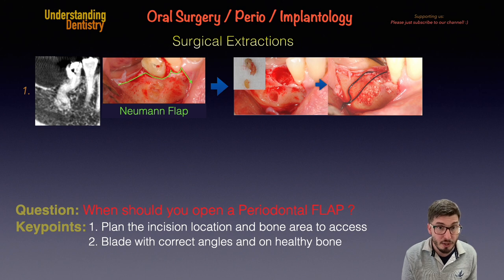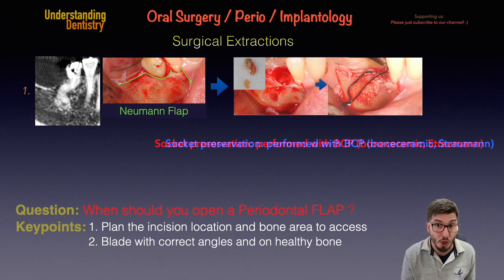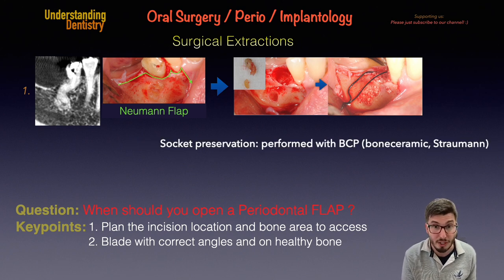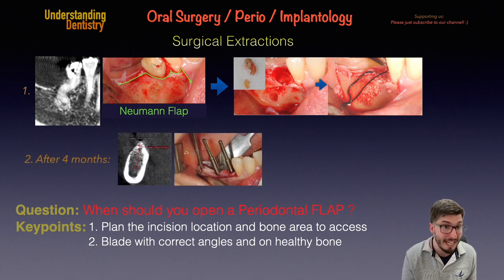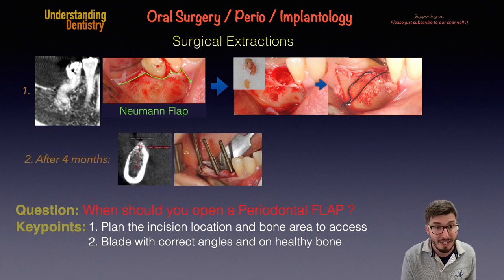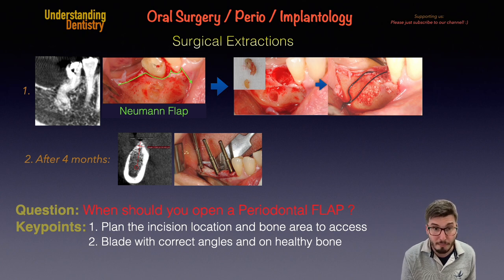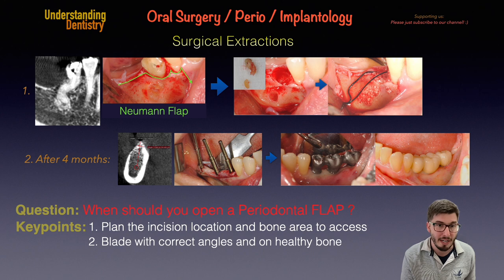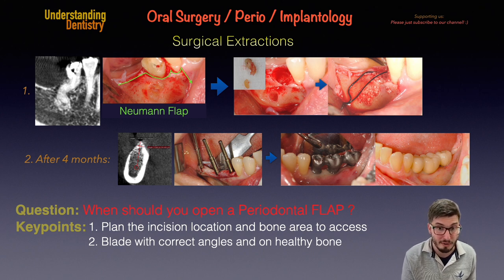After the surgical extraction, we grafted the socket with a socket preservation procedure, as this was part of an implant planning case. You are now seeing the implant planning and implant placement surgery on the healthy bone, resulting in a rehabilitation of three splinted implant-supported single crowns.